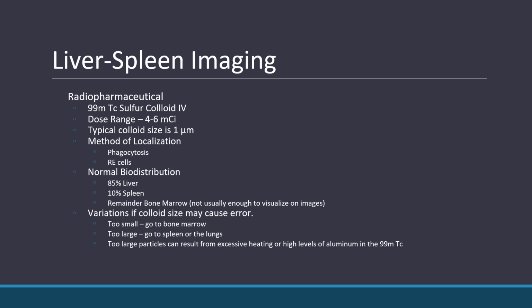So the radiopharmaceutical for this is 99m technetium sulfur colloid. The dose range is about 4 to 6 millicuries. The typical colloidal size is about 1 micrometer.